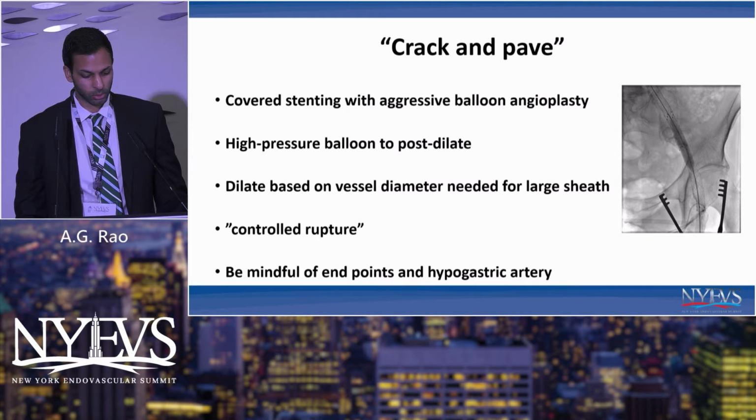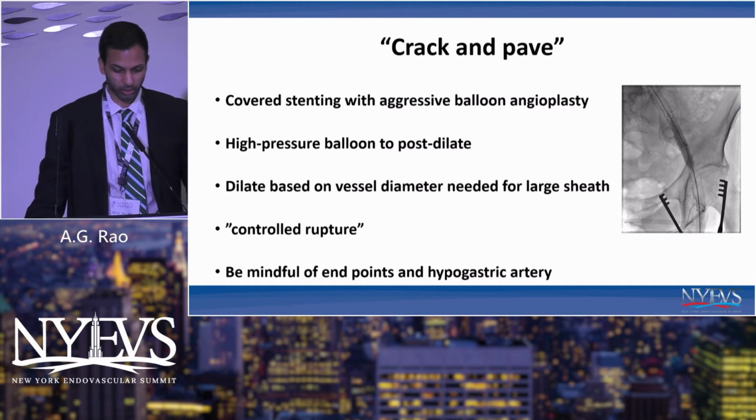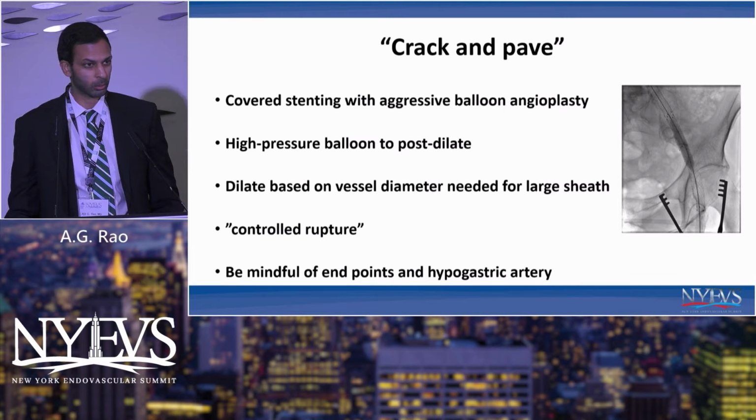I think with this sort of technique, you have to be very mindful of your endpoints. So, your endpoint at the common iliac artery and your endpoint near the hypogastric, if you're trying to preserve that, because those are areas that you could disrupt where you can't really seal that easily.